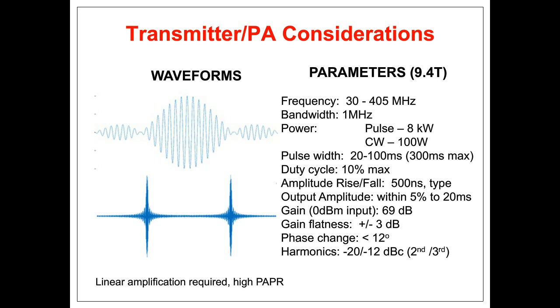Because we're talking about phase, frequency, and amplitude as part of the creation of the K-space representation, which gives us the image, and that can potentially take many minutes. That PA, even with those power levels, has to have very, very good stability and phase properties. It also has to be very linear because there are PhD theses on shapes of pulses and pulse sequences.